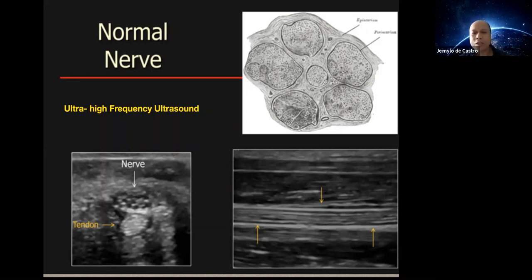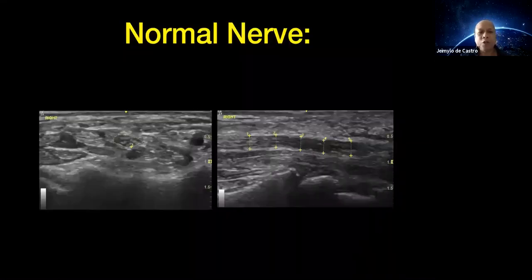In the long axis view, you can see a trilaminar pattern. Here you see the echogenic peripheral side, and then hypoechoic at the middle portion of the nerve, which indicates that this is really a normal nerve. There is no notching seen here. So this is also another view of the normal ultrasound, which we see in the patient.